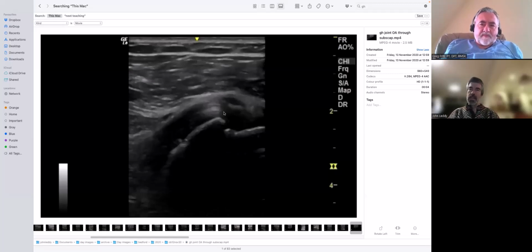Now I'm of the opinion that ultrasound is at least as specific when you see it. What you don't see reliably on ultrasound is loss of cartilage. Yes. So they can have cartilage wear, though when it's severe, you can see it. You look at the back of the joint and you go, the glenoid is not normally that closely aligned to it. But that's in a fairly severe case of arthritis. You go, oh yes, I can definitely see a loss of cartilage there.